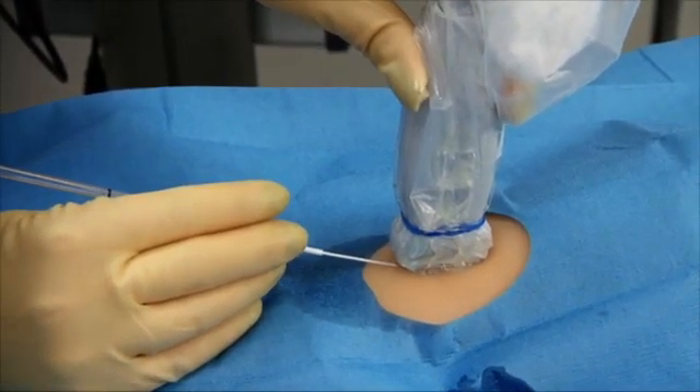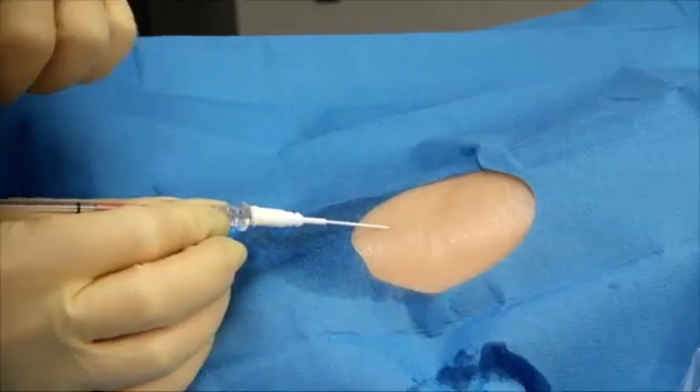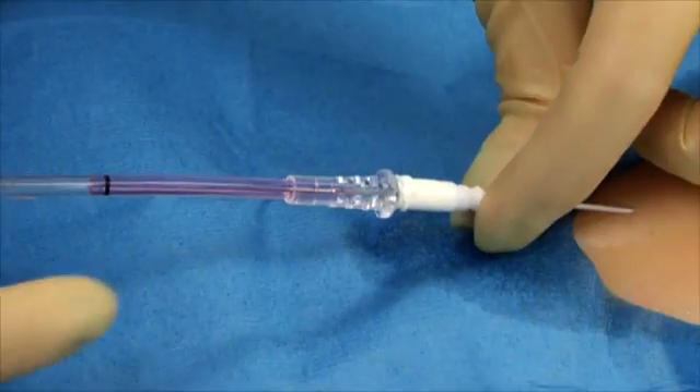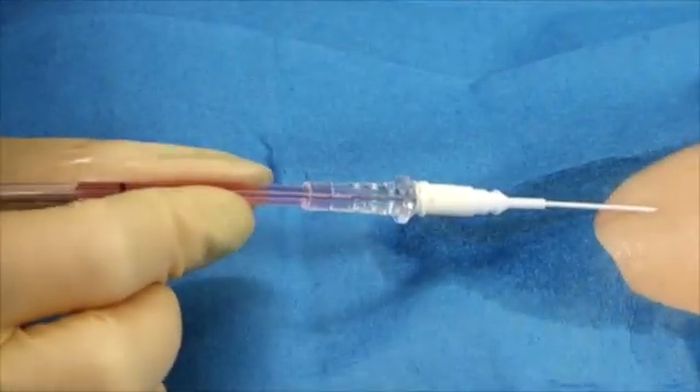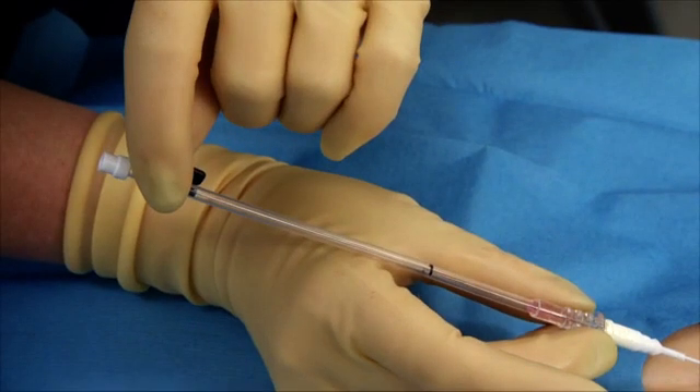Once blood flow is visualized in the wire housing, stop the advancement of the needle. Blood flashback in the clear hub of the introducer needle indicates a successful entry into the artery. Avoid transfixing both walls of the artery, as subsequent advancement of the spring wire guide could result in inadvertent subarterial placement. Use of ultrasound can help prevent this. Advance the entire placement device a maximum of one to two millimeters further into the vessel to ensure the catheter is seated within the vessel.